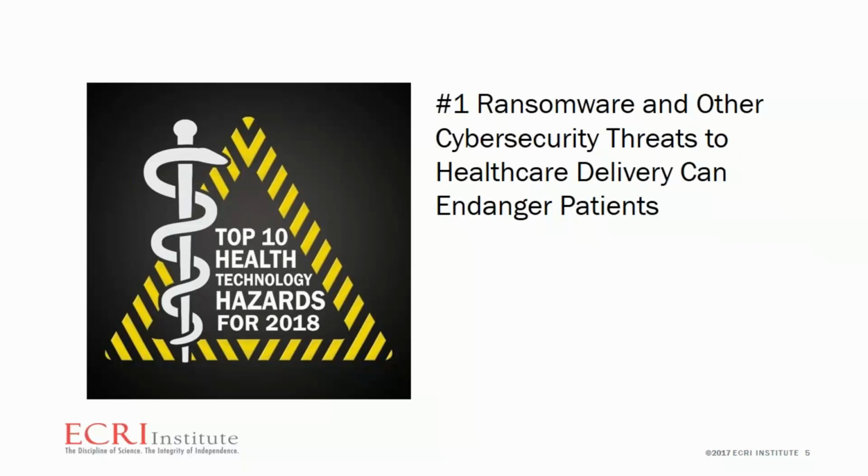As many of you are probably aware, ECRI rated cybersecurity and ransomware threats as the number one top 10 health technology hazard for 2018. This is primarily due to the reason that last year we started to get reports of cybersecurity-related disruptions to healthcare operations, even causing closure of certain healthcare units, leading to delays in patient care, which can absolutely cause patient harm.